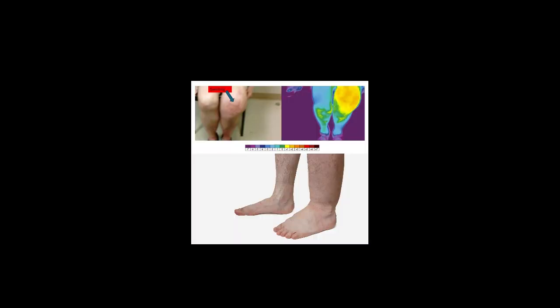Now, there's other technology that we can utilize for this, near-infrared spectroscopy and multispectral, which we'll cover in another episode. But other things that can increase hypoxia would be swelling, and we'll discuss that in another episode. So the point here is to make sure that you get that wound bed that has a prolonged hypoxic center to get more oxygen to it.